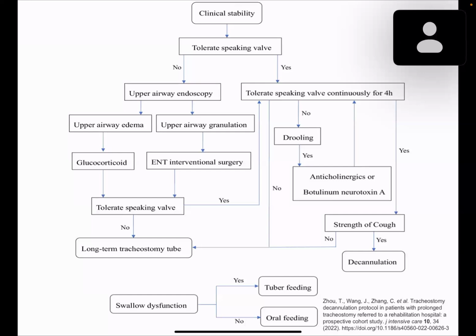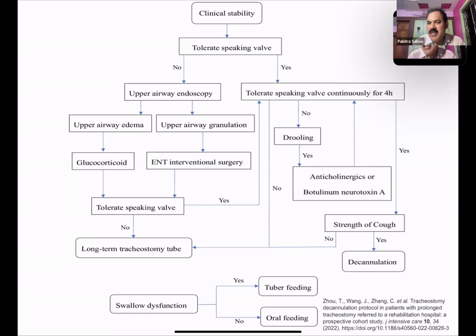So there is no cleaning and recycling thing. And with metal tracheostomies, the patient's relatives are quite confident in using them and even steaming them or putting them in a pressure cooker and boiling them. So maintenance is, moreover, pretty easy. This is, I think, very helpful for long-standing patients. Yes, sir.